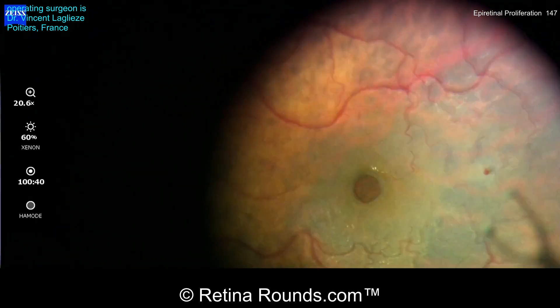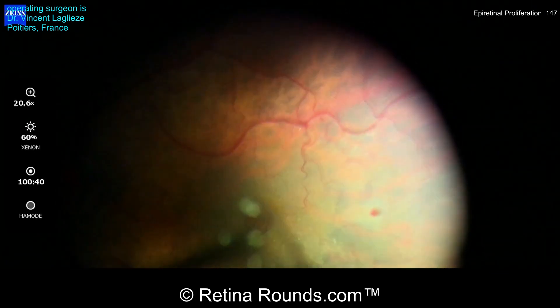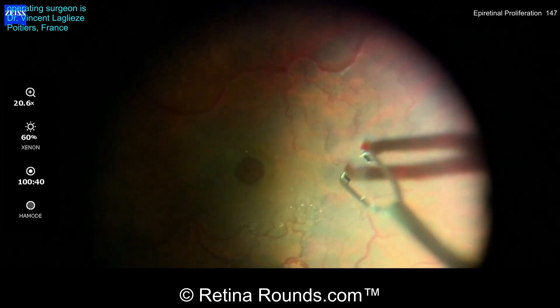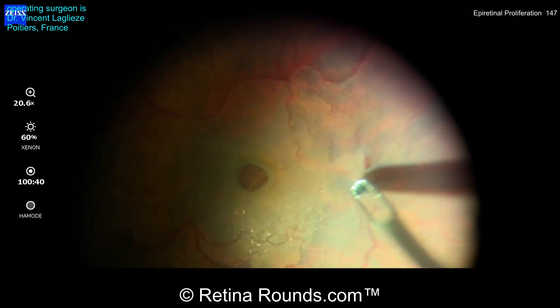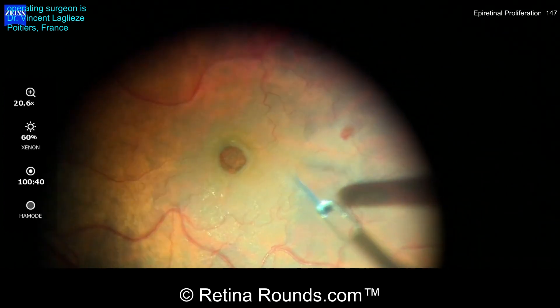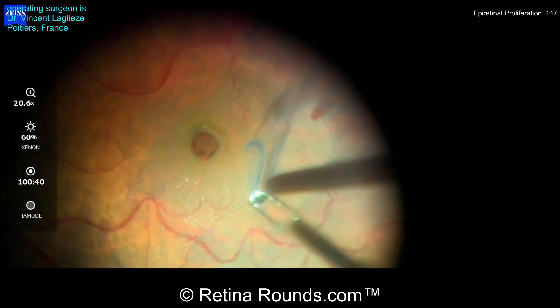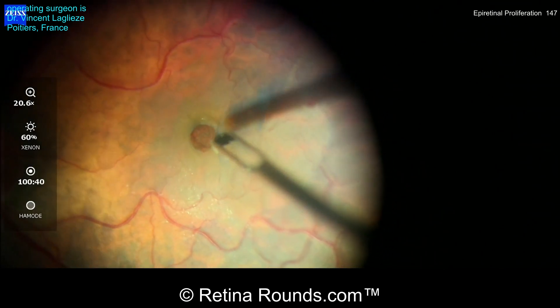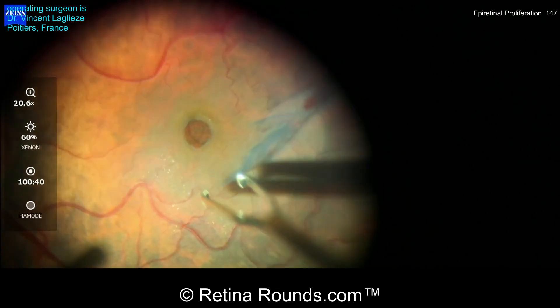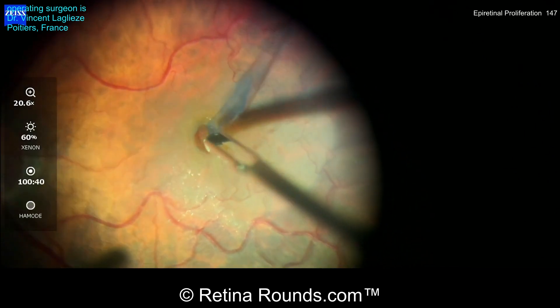You can see here that he has gently elevated a strip of the ILM. Sometimes these little petechial hemorrhages can form as a consequence of fracturing or peeling the ILM, so we'll have to keep an eye on that to make sure it doesn't expand during the course of the case. Once the ILM is fractured, Dr. Leglaise is going to extend the peeling supra-o-temporally, and now is pulling more centrally to elevate not only the ILM, but also the epiretinal proliferation.